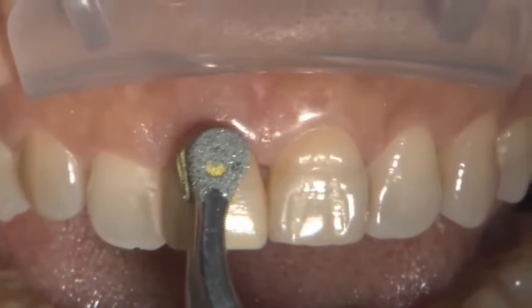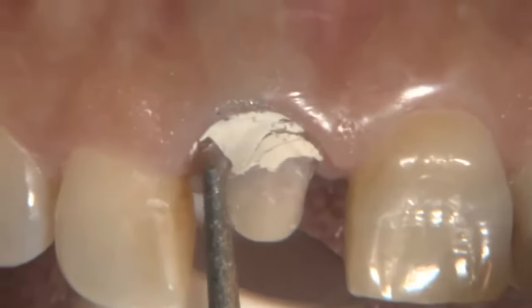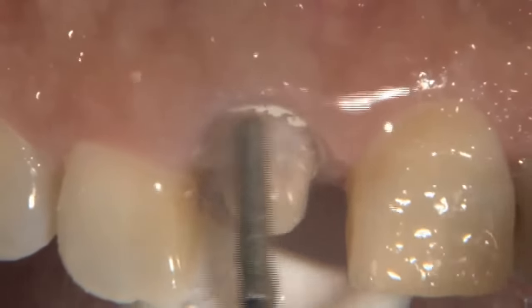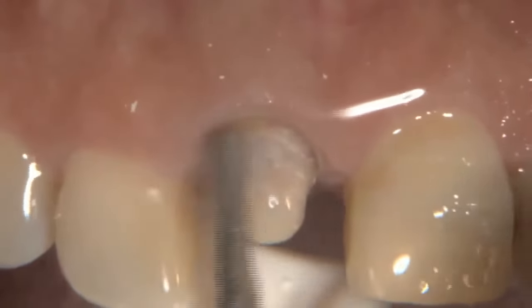I wanted to take you through a clinical case here. We're removing the temporary crown on tooth number eight. As we get ready to remove the old cement as part of our first step, I'm just using a sonic scaler here to make sure that the tooth surface is nice and clean as we get the temp bond temporary cement off.